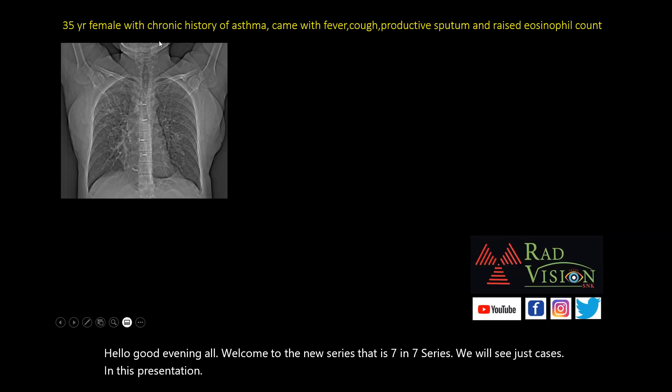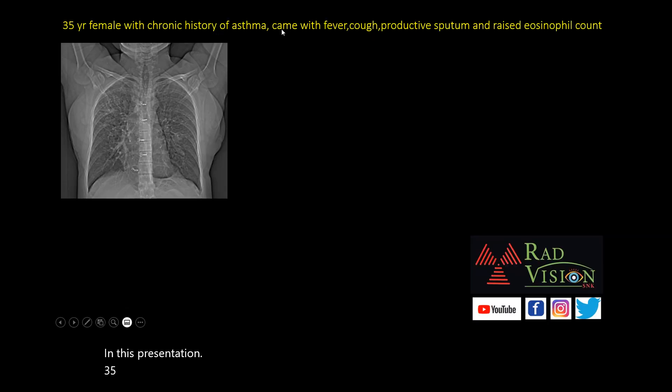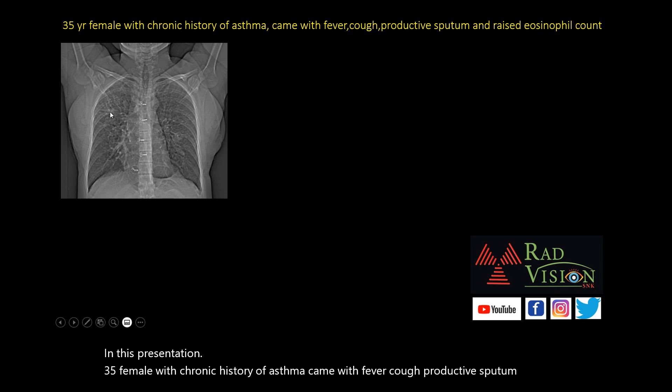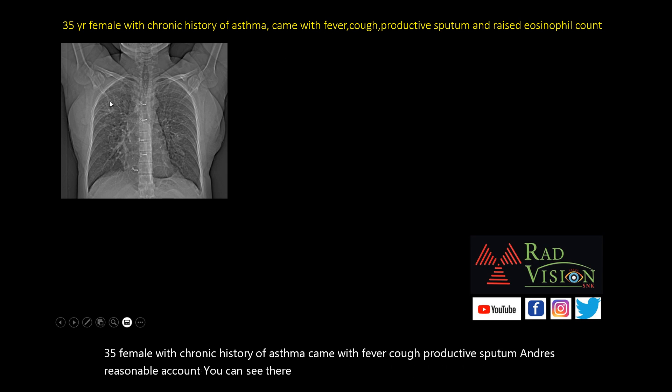Case 1: A 35-year-old female with a chronic history of asthma, came with fever, cough, productive sputum, and raised white cell count. You can see there are linear opacities in the right upper lobe and even prominent bronchovascular markings.